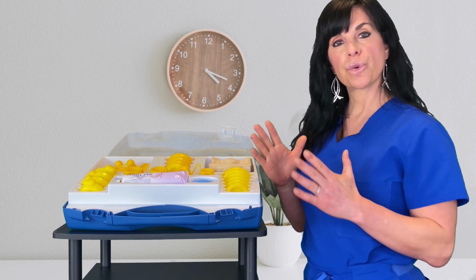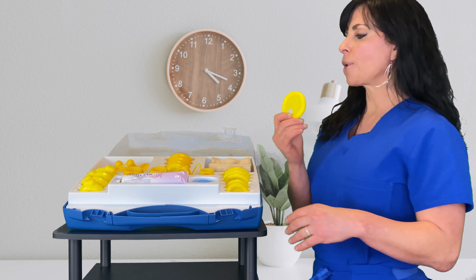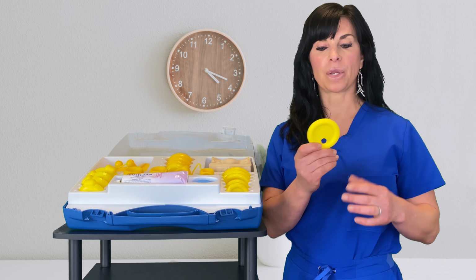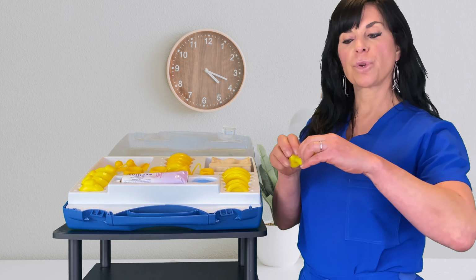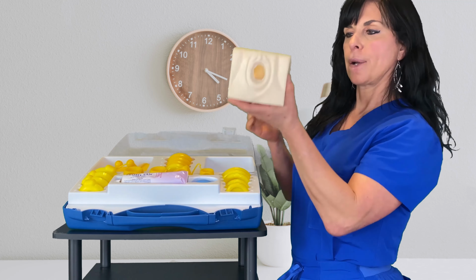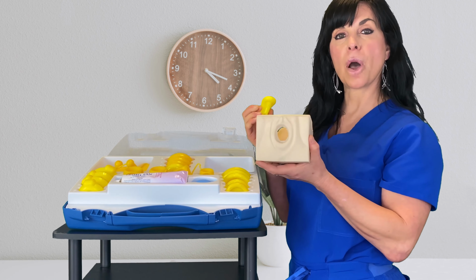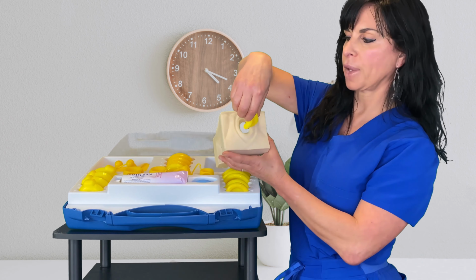So now I want to go over how you would place a pessary. I'm going to show you a ring pessary. This is the most common one that we end up using because it's the easiest for the patient to manage. So when you insert it, what you do is you first fold it over like a taco. Then you take, in this case, the model, but you're going to take one hand, your left hand, or if you're right hand dominant, and spread your labia with that one while you insert with your other hand.